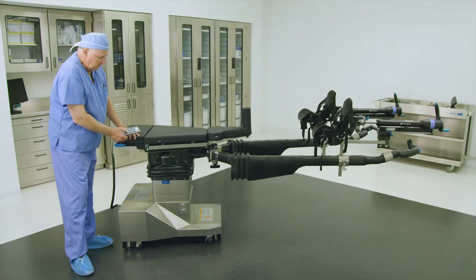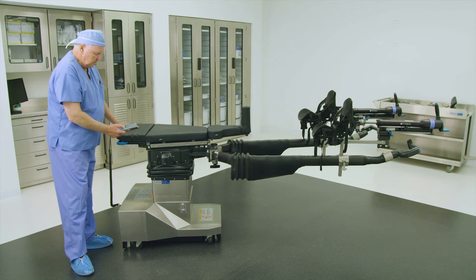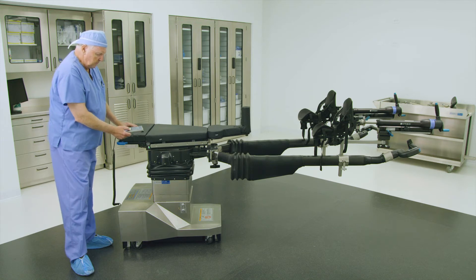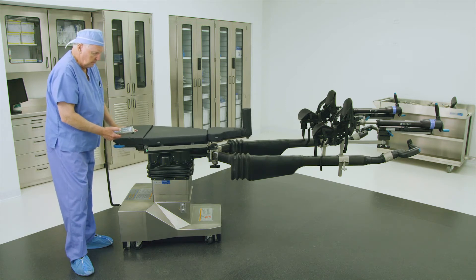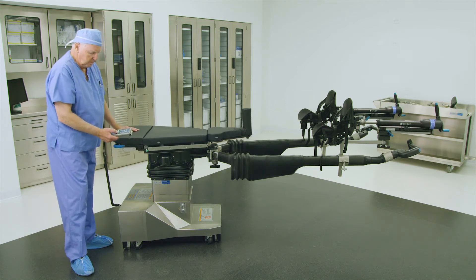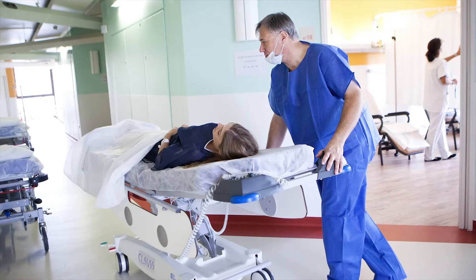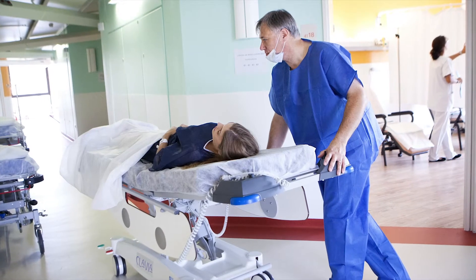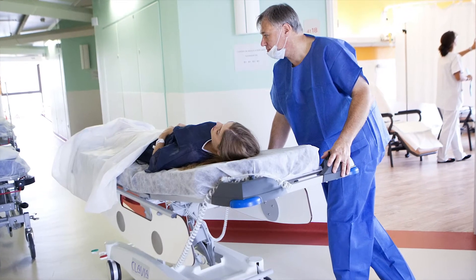Press and hold the green unlatch button on the hand control, and then physically push the tabletop laterally left or right until it locks in position. The table is now ready for patient transfer.